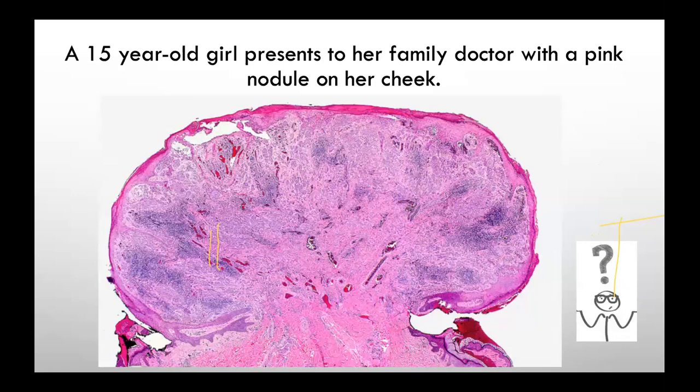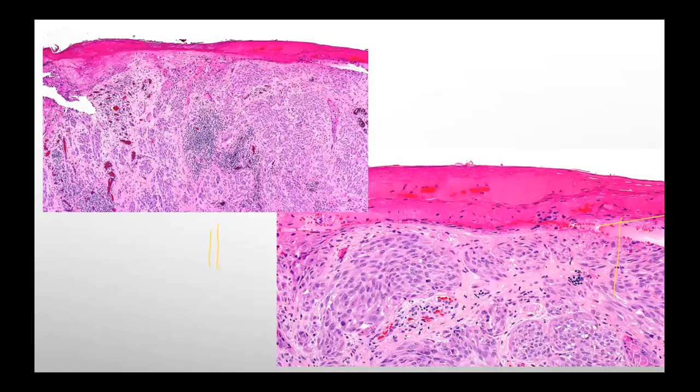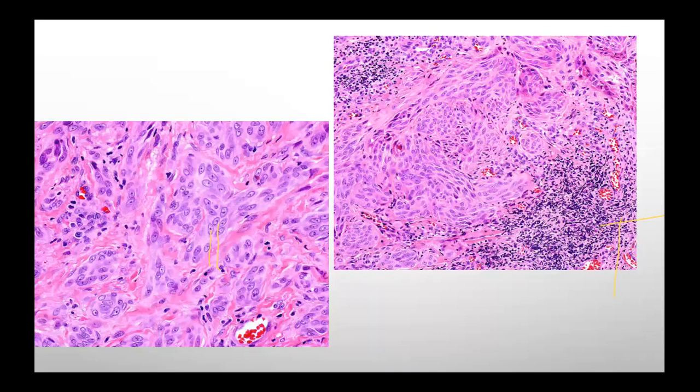A 15 years old girl presents to her family doctor with a pink nodule on her cheek. Okay. Going to a higher power. Anybody know the answer?